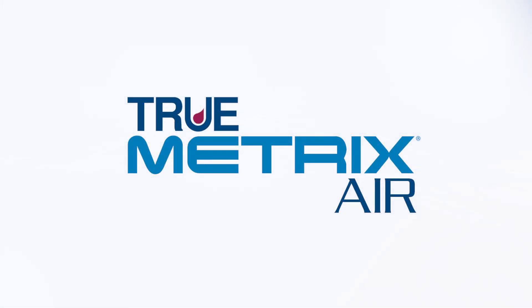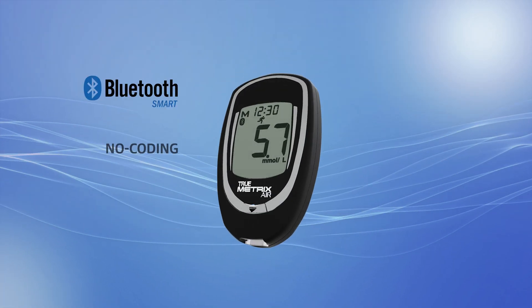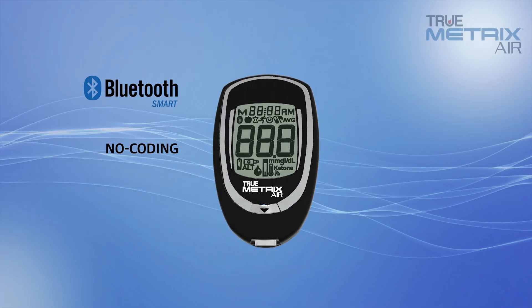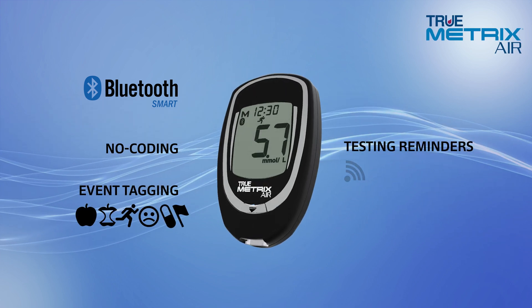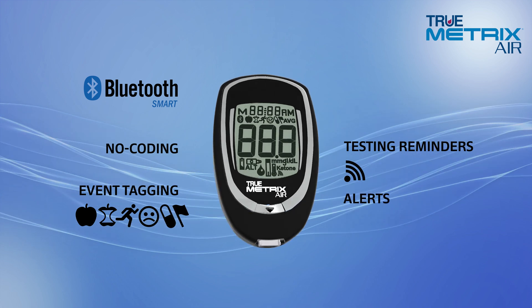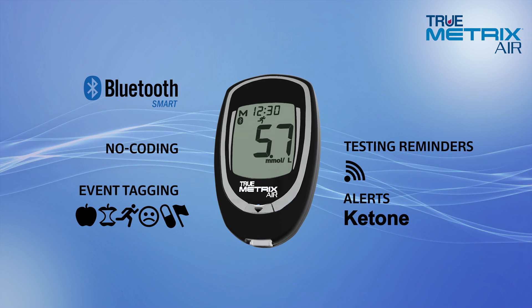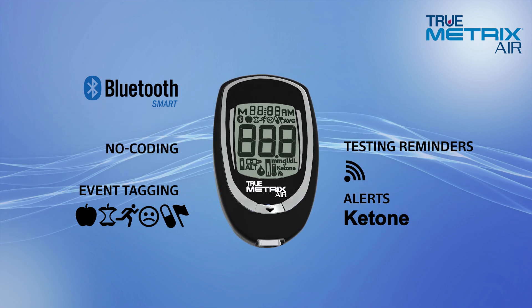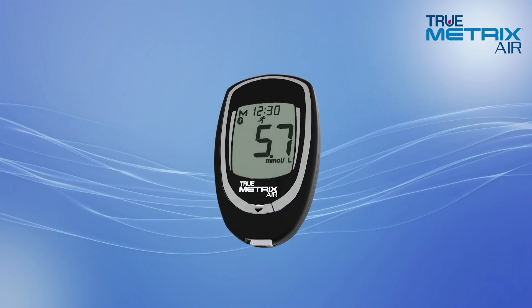Introducing the TruMetrix Air Blood Glucose Monitoring System, featuring Bluetooth Smart and TripleSense technology. It is a no-coding, full-featured system. TruMetrix Air is technology with reach, with integrated wireless capability. Results are seamlessly delivered to a mobile device to provide simple tracking and insights, empowering you and your healthcare provider to make better decisions for a healthier life.